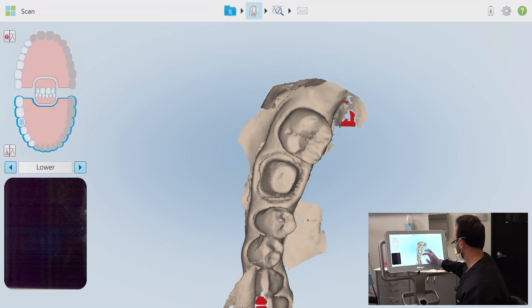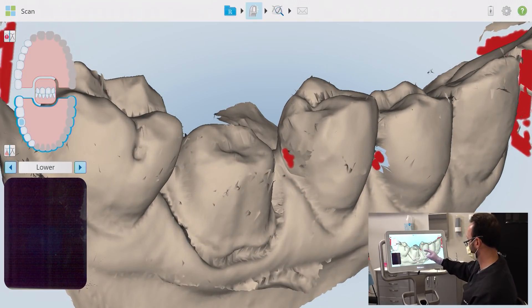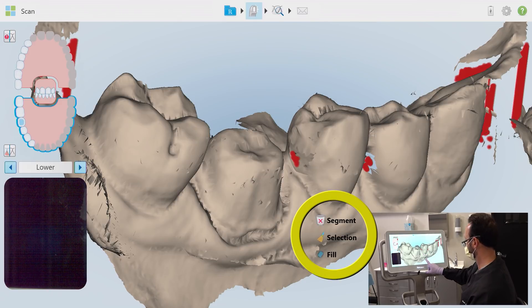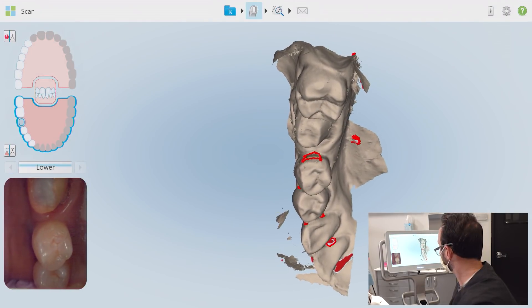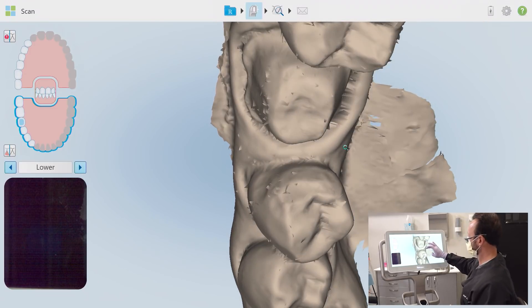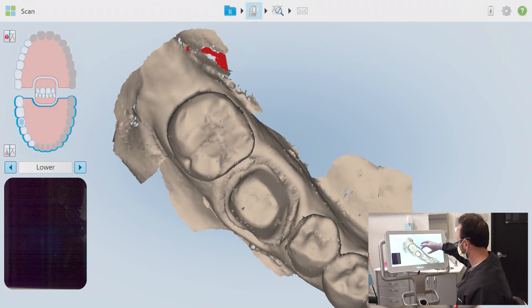I've stopped the scan at the buccal anterior and I'll visually review the complete scan to check for any missed areas. I can see that the distal contacts of 28 and 29 still need to be filled in. Since the iTero shoots at an incredible 6,000 frames a second, I only want to patch the missing data areas by using the fill feature. I'll press and hold my finger on the screen until a secondary menu opens and choose the fill option. The unit suggests areas outlined in red that may need to be filled in. Once I start scanning again, only the missing data areas will be added to the segment. After filling, another review shows all missing areas are filled to my satisfaction. Red areas that remain don't interfere with the data — they're just scattered data from previous scans.